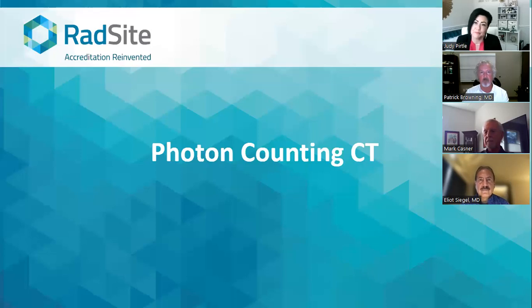I think that would be the driving point of whether you would switch and upgrade your machine versus keeping your old machine. And Judy, the lifespan of CT has really dramatically increased over the past several decades, right? It used to be at RSNA every 3 years you'd have to buy a new CT scanner. Now I audit places where the CT scanner is 17 years old and it's working great. Yes, you only have to replace parts, right? Not a lot changes with it. What wears out the quickest is the tube, so you can keep replacing the tube and the machine keeps going.